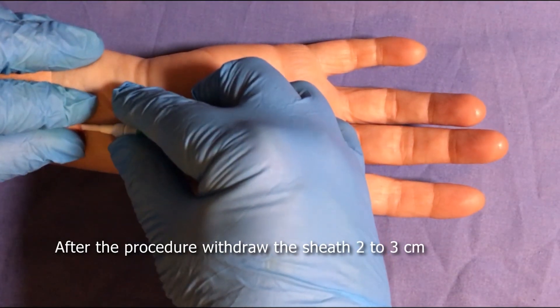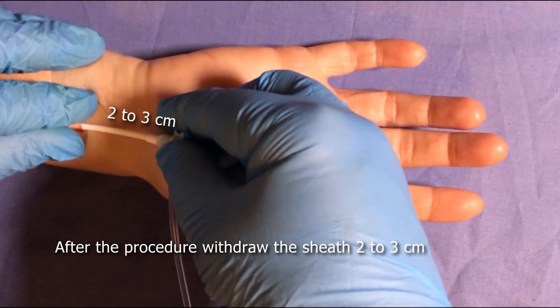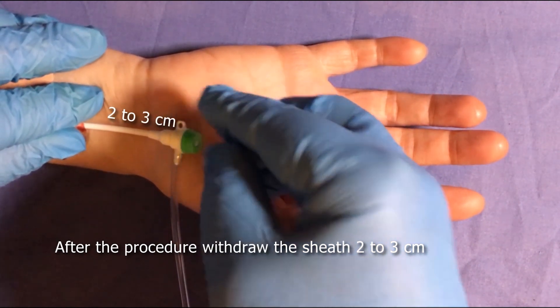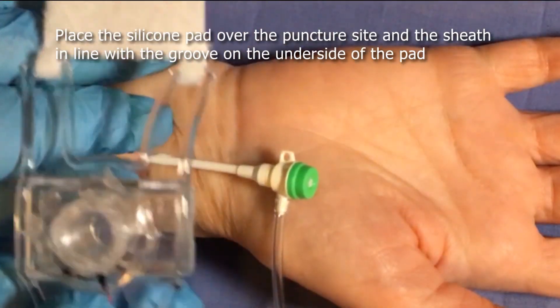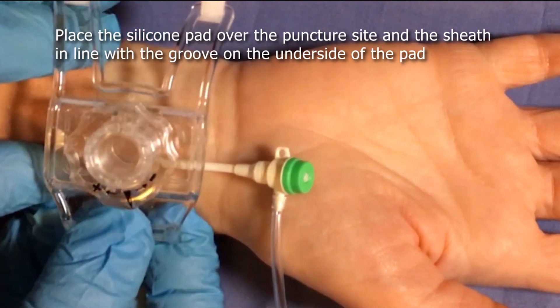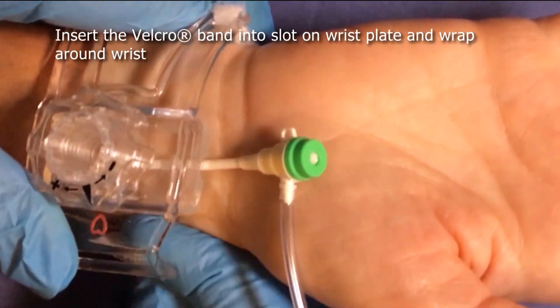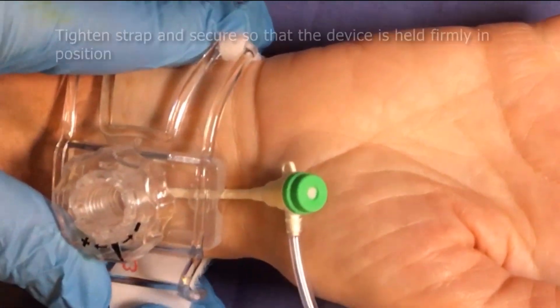After the procedure, withdraw the sheath 2 to 3 centimeters. Place the silicone pad over the puncture site with the sheath in line with the groove on the underside of the pad. Insert the velcro strap into the slot on the wrist plate and wrap it around the wrist.